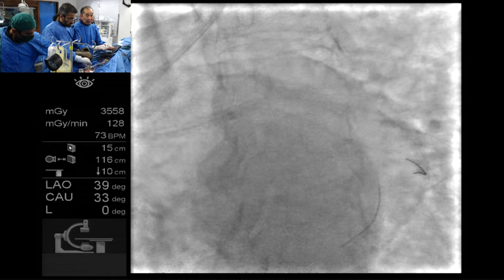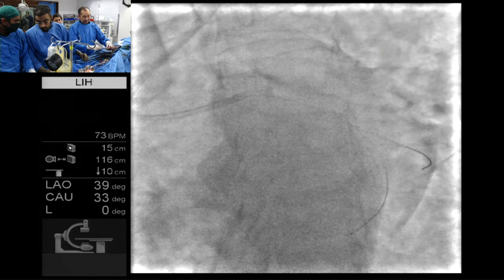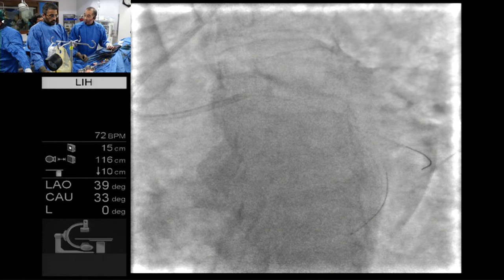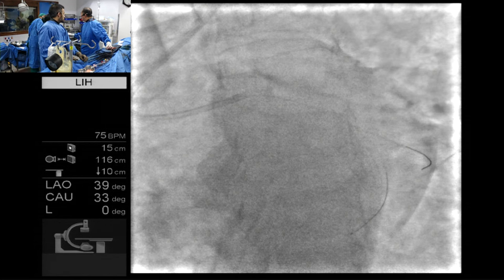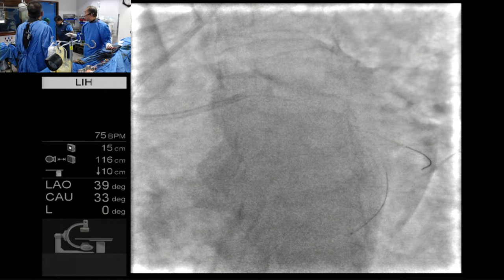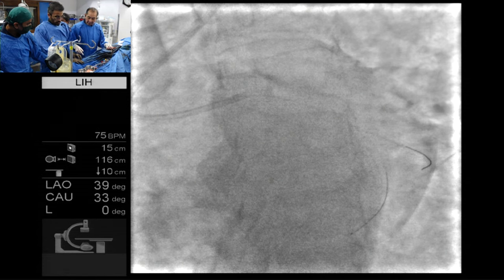I think the first balloon goes into the main vessel and can anchor and support. So I need to get the balloon here. We have a 3.5 balloon or 3.0 balloon. We have 3.0 NC. You want 3.0 for the main branch? Yes, because we did a POT with 3.5 in the main branch. That's okay, 3.5 is fine. I have 3.5 and 2.5. Using low pressure in the 3.5.